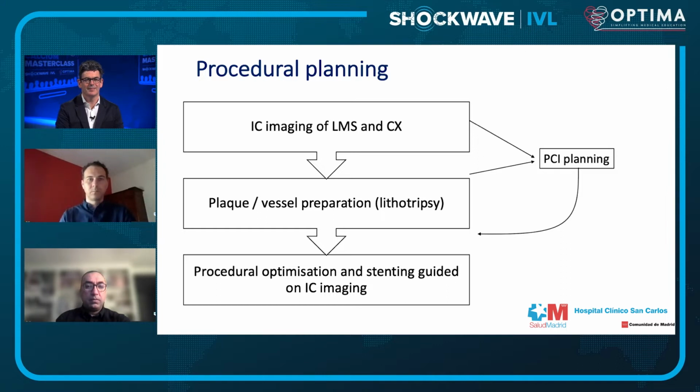We have obviously calcium at both sides of the artery, but there's a huge calcific nodule that you will see in a second. And we want to really act in depth into this nodule calcium to make it as plastic as possible, so we have less risks when expanding the stent that there is any potential complication. So what we've done so far, let me just show you some of the pictures we have obtained so far.